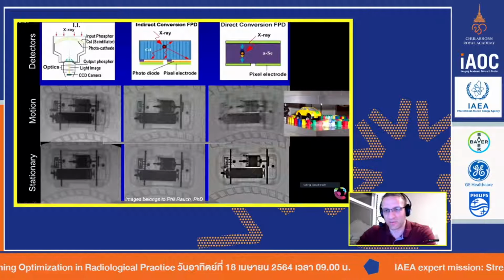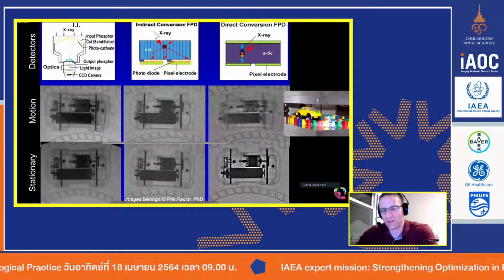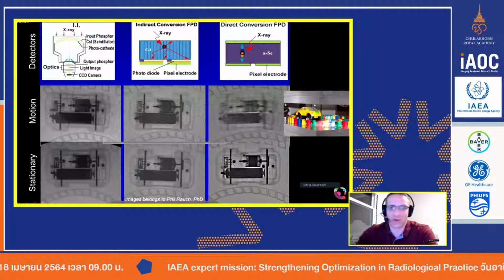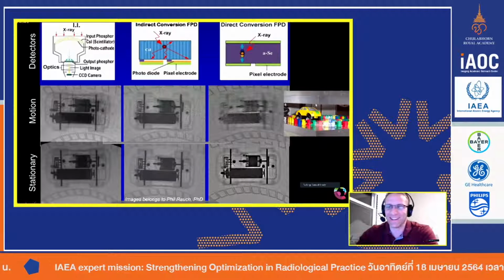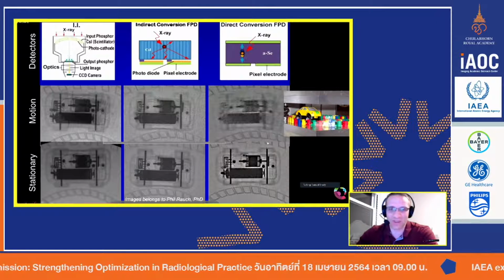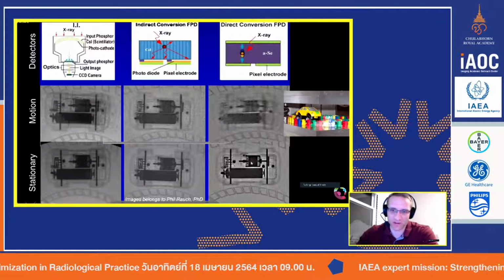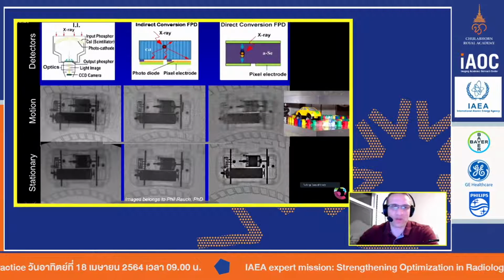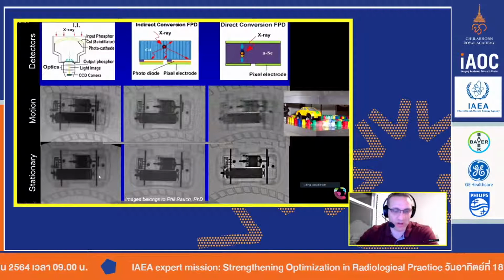Basically, it's just a couple of PMMA phantom blocks that cause the system to use a specific KV, but it's just a car on a track that goes in circles. It's a toy. Probably took it from his son or his daughter, and it just goes in circles on top of the fluoroscopic table. So he can capture that car in motion, and then obviously he can turn off the car and it can just stand there stationary.